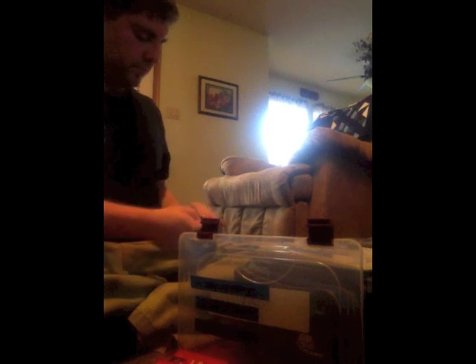I would consider this the most important. This is my diabetic section. And what we have in here is a glucometer, glucose meter, whatever you want to call it, strips and everything, for checking blood sugar. We have some alcohol wipes when you're checking blood sugar to clean off the skin from dirt. Then we have liquid glucose for people that are hypoglycemic. So if they are low on their sugar, give them some of these, and it should be good to go.